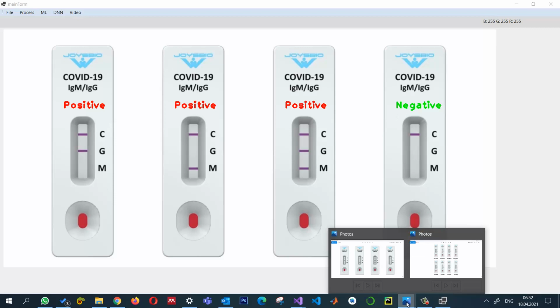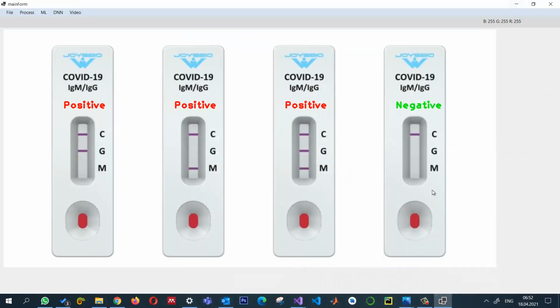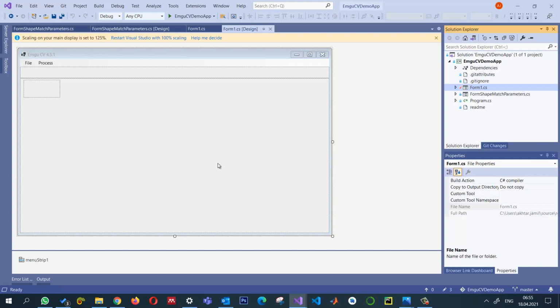So according to the information provided for the positive and negative test, we will be focusing on this part only. So let's see how we can do this. I have already created a project in a Windows Forms application and configured it to use Emgu CV 4.5. You can check one of my previous videos.